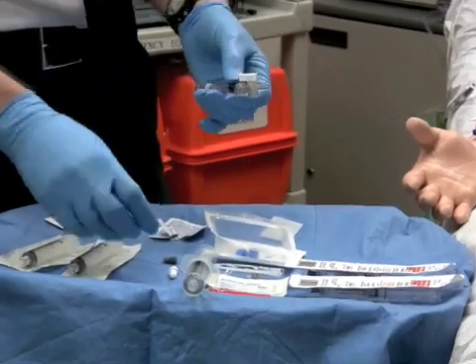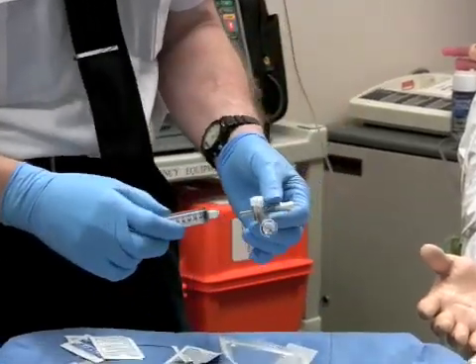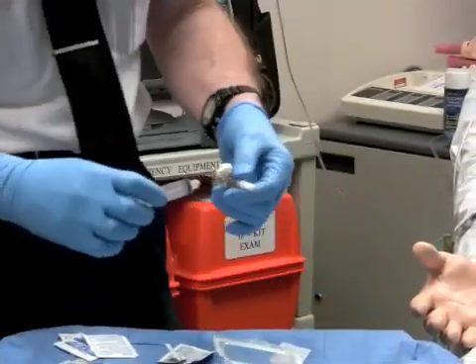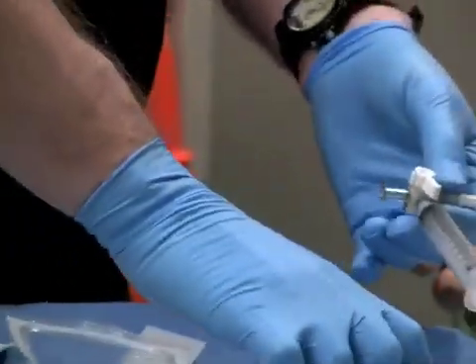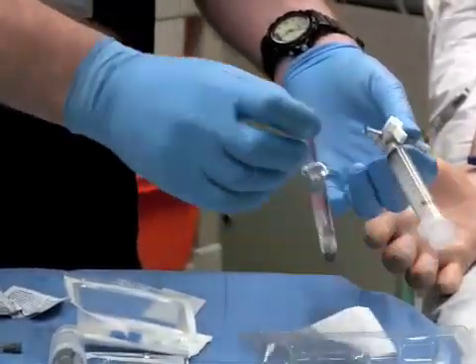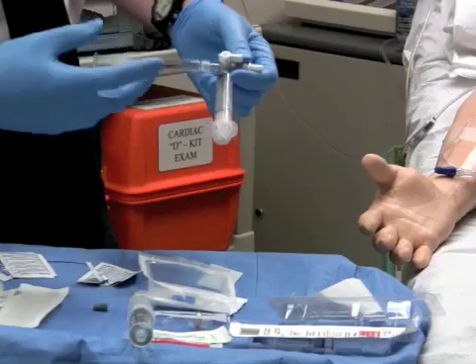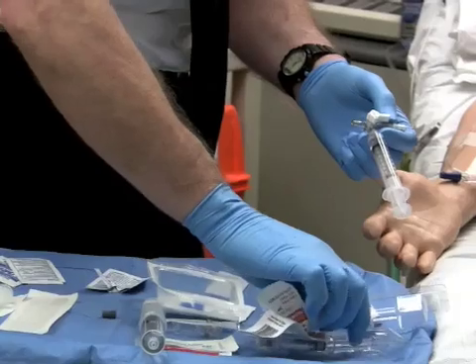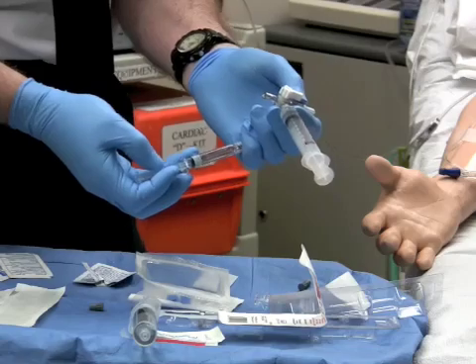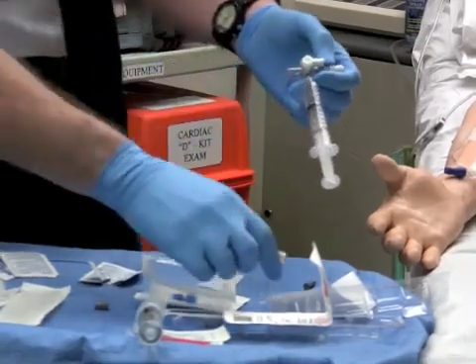Use a three-way stopcock to fill a 10cc empty syringe. You're going to mount this where the 6 milligram syringe was, and you're going to take two more adenosines and fill this syringe by pressure. That would be the orientation — fill the syringe. Here's the first six in. The patient has not improved. There is our second six in, and we now have 12 milligrams.